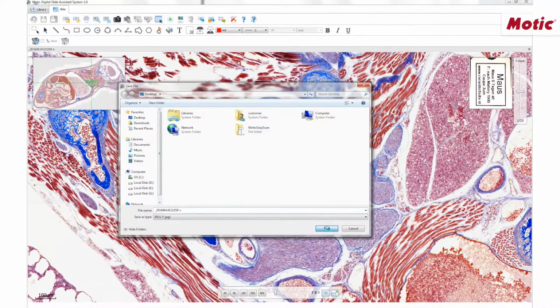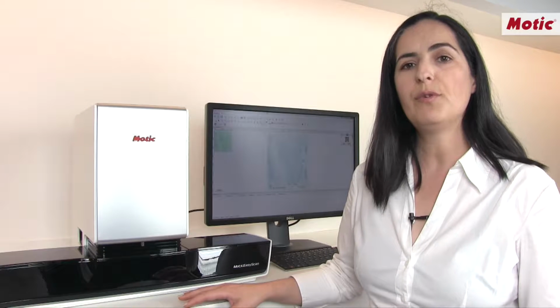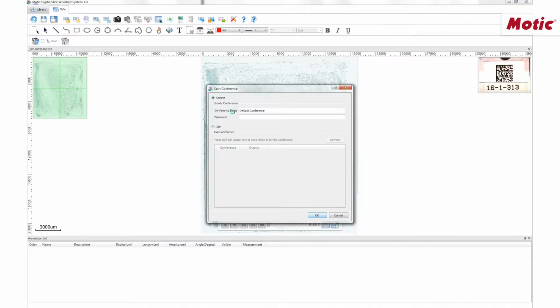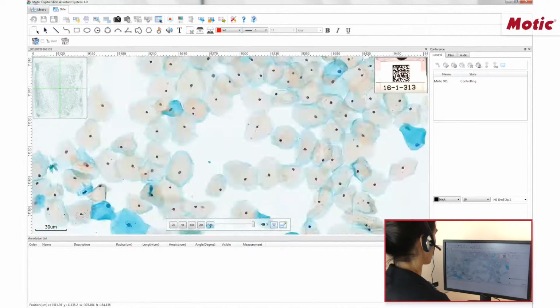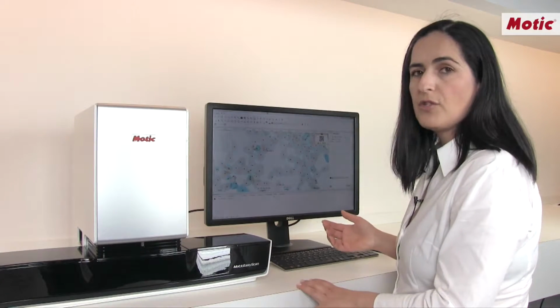An easy and effective approach to have a second opinion on a diagnostic is to use the conference tool for remote network sharing. This is a function that will allow third parties to interact with the digital file. Other users can see, edit and comment the image using our free version of the software, which, as I said, is available through our websites.